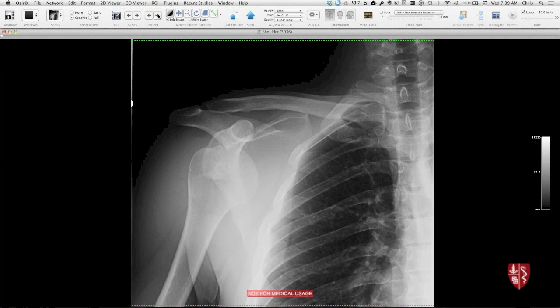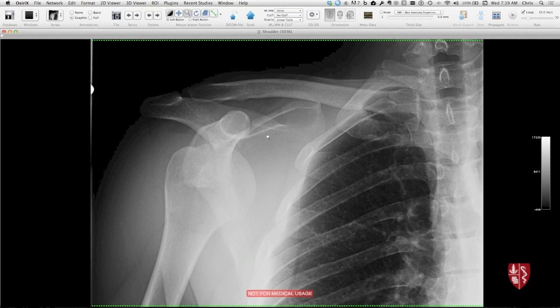So that's just some basic normal anatomy. From the audience, what are we looking at here? Anterior inferior shoulder dislocation. So this is an AP view, and you can see that the humeral head here is projecting medially to the glenoid and inferiorly. Typically these dislocations are anteroinferior — that's the most common type of dislocation.